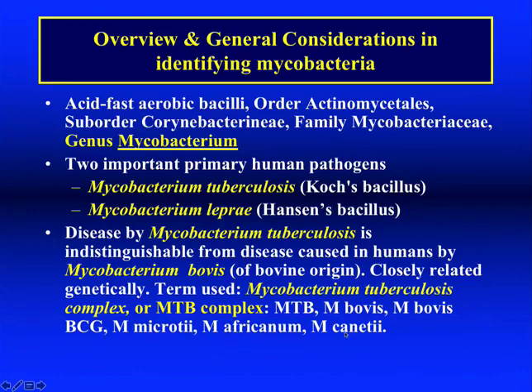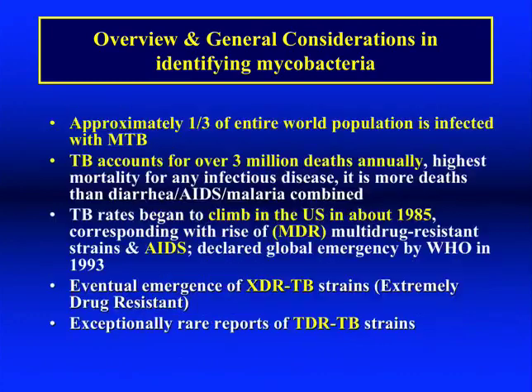Most of the amplification methods used in the US that are FDA approved are directed against MTB complex. And in our country, perhaps a positive for MTB complex means MTB most times. But that is not the way it is in the rest of the world, where such PCR methods have to be then developed to be very specific to the different agents within the MTB complex.